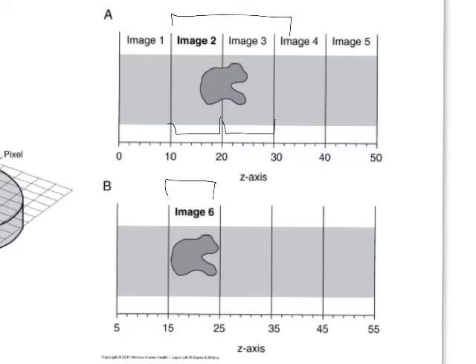Think about it like a steak versus the thinly cut turkey meat from Hillshire Farms or wherever. If we've got the turkey meat, there's less volume averaging. If I've got the steak, I've got all the fat and all the junk and everything between the top and the bottom of the steak.